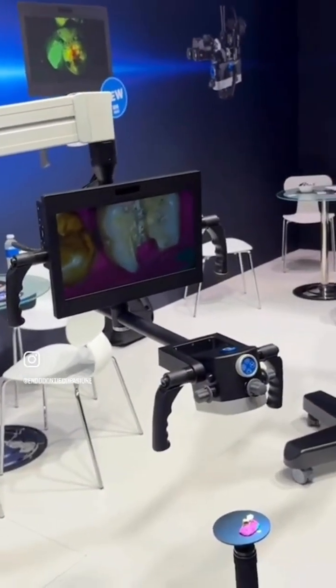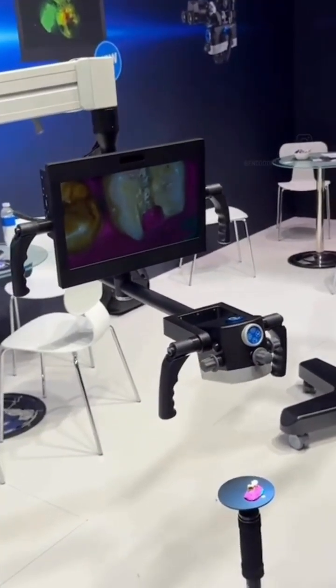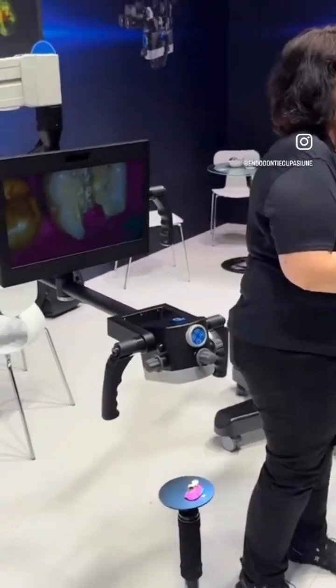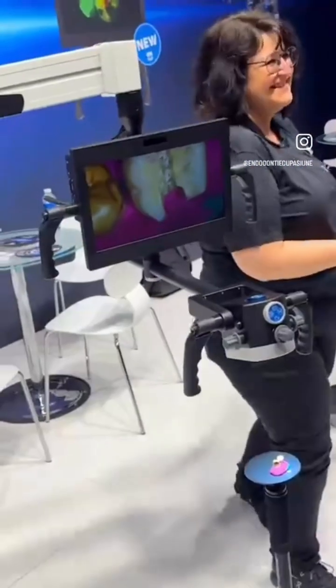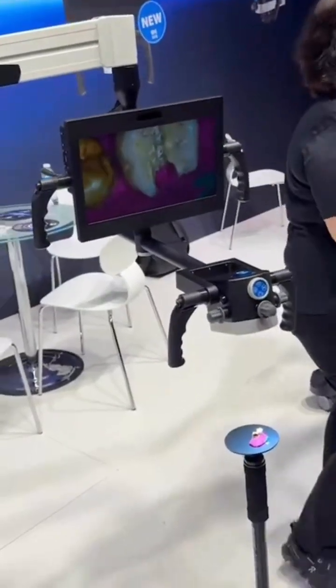You also have fluorescence on the microscope, which you can see on the screen — again, something really nice. Overall it seems to be a great product. It's probably one of the best functional 3D microscopes I have seen.